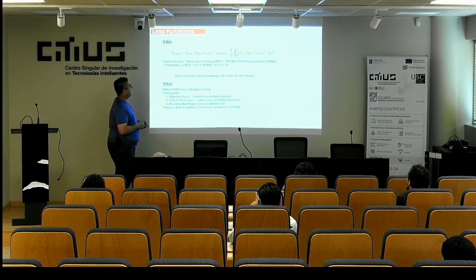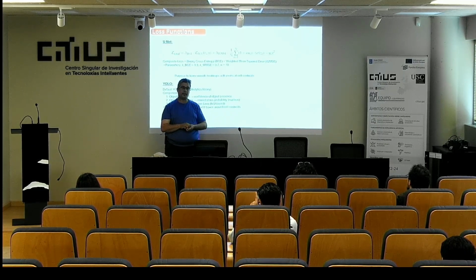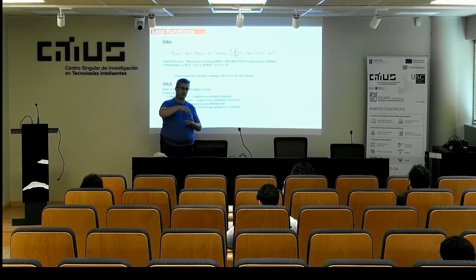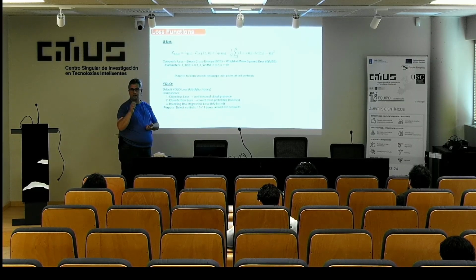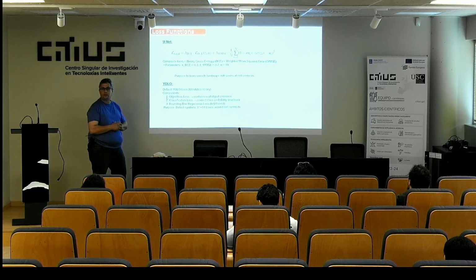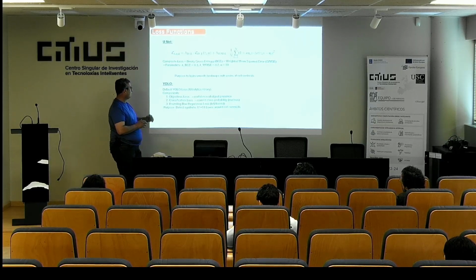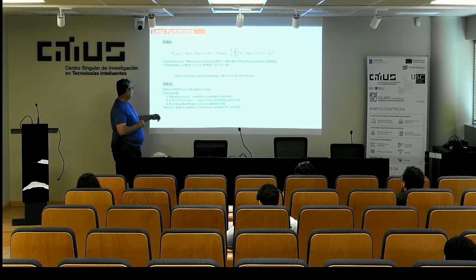Okay, and we use the weighted mean square error to emphasize the cells themselves, the centroids of cells, giving that function the highest value to detect. Okay, about YOLO, we already use the default loss function.